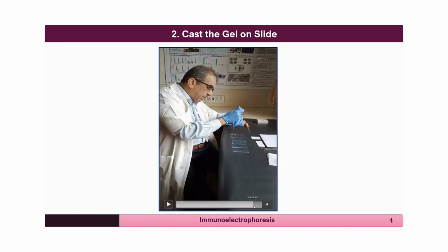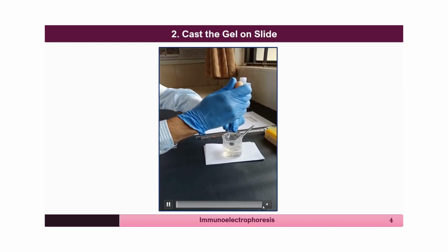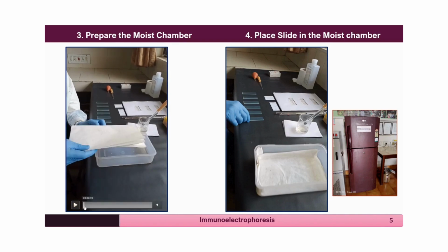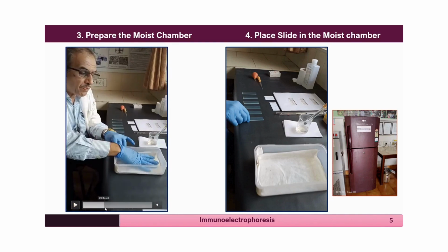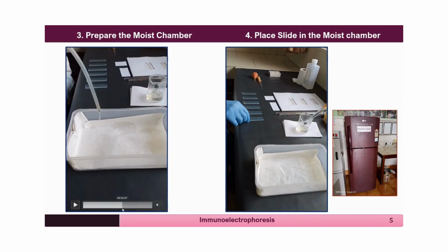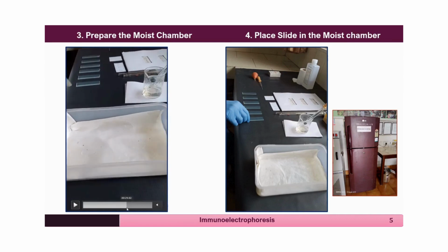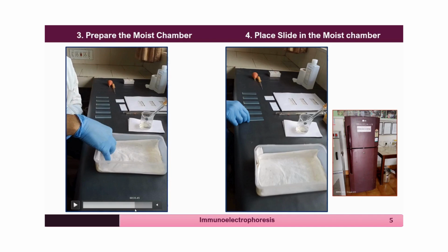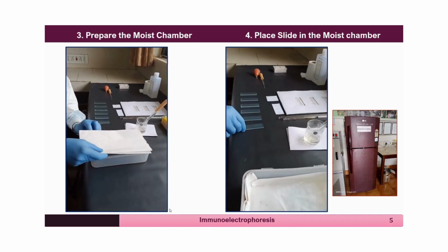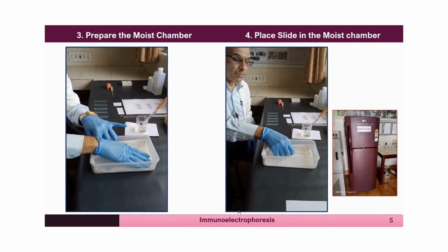And once the slide is prepared, it is supposed to be kept in the moist chamber for the agarose to solidify properly and for even distribution of ions in the slide. And it was already explained how to prepare the moist chamber by using a bedding of filter paper, which is moistened with distilled water. And in that moist chamber, you keep the slide for about half an hour.